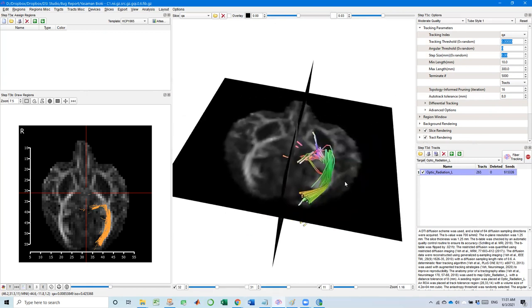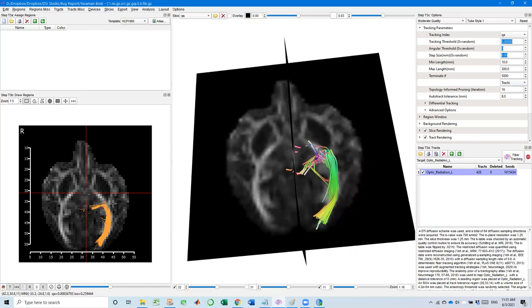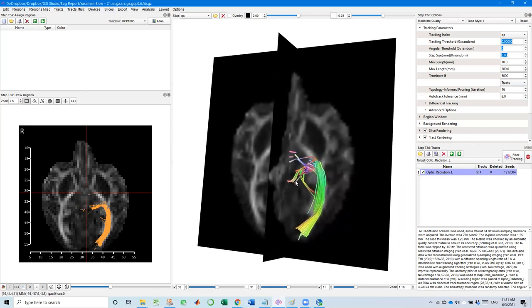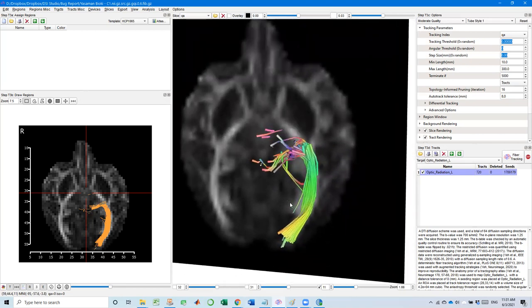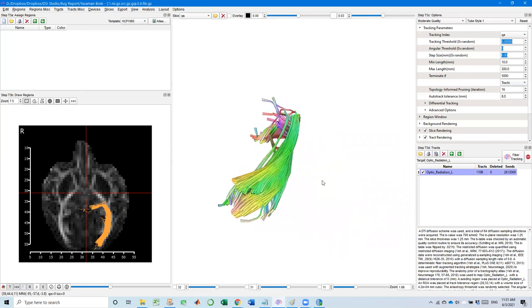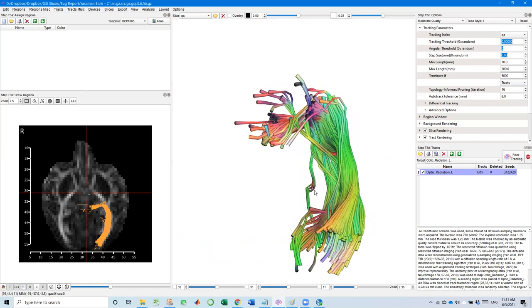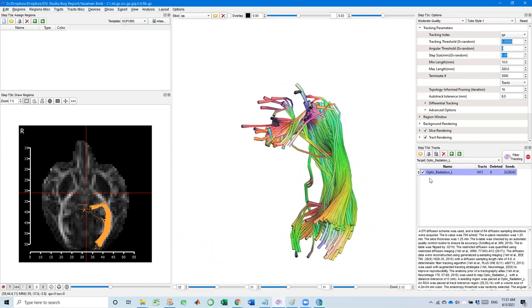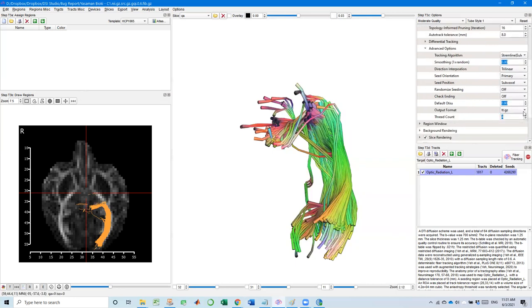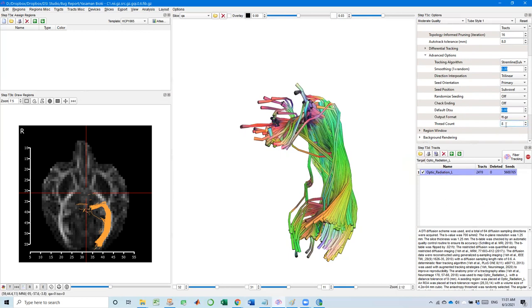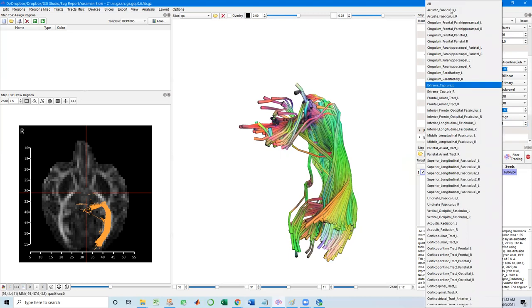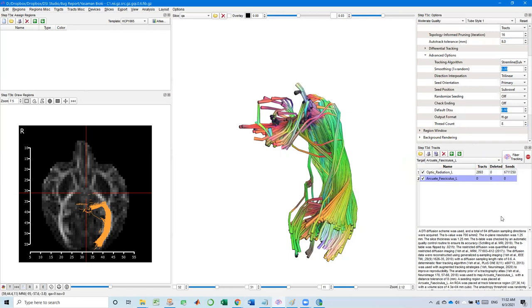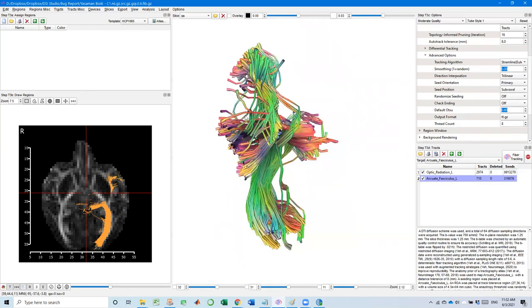So let's hit go fiber tracking. As you can see here, the DSI Studio kind of capturing the optic radiation nicely, even though there are some noisy tracks coming out. But later on, once this mapping finish, pruning will remove those noisy tracks. So it's pretty nice. I would say we actually really got this working by just feeding monkey brain into human automatic fiber tracking pipeline. To make it faster, I can increase the thread count. So on my laptop, we can at most get eight multi-thread. And once I change this, I have to do the fiber tracking again. So at the same time, let's try other tracts. I say arcuate fasciculus on the left. See if it works out.